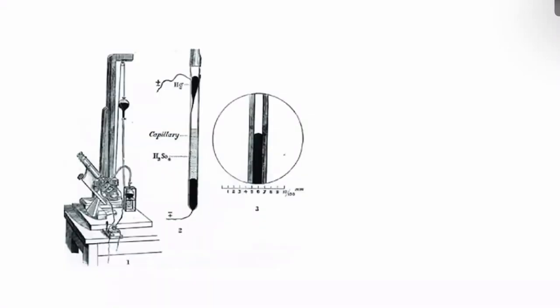So this is the capillary electrometer developed by Lippmann in 1873.